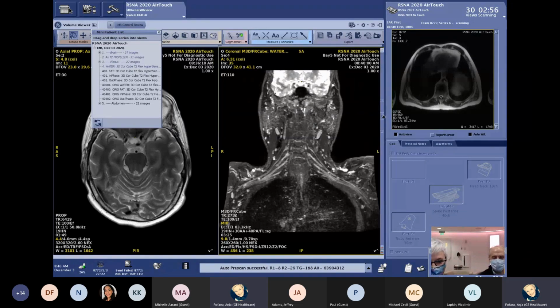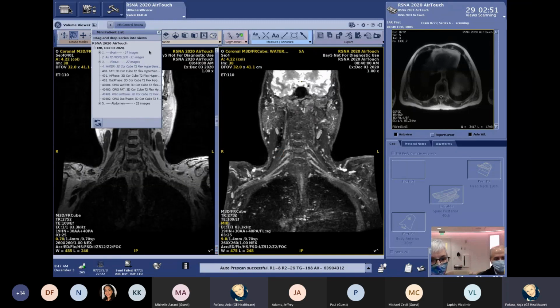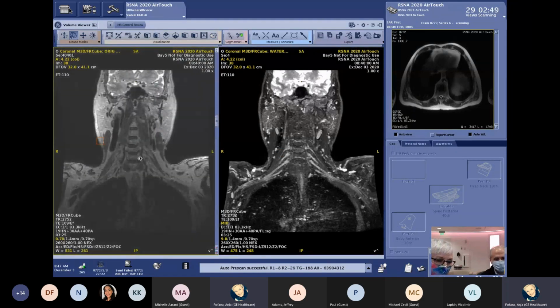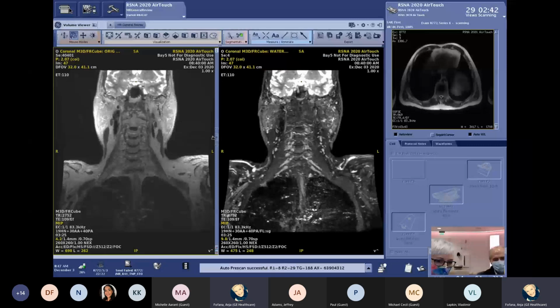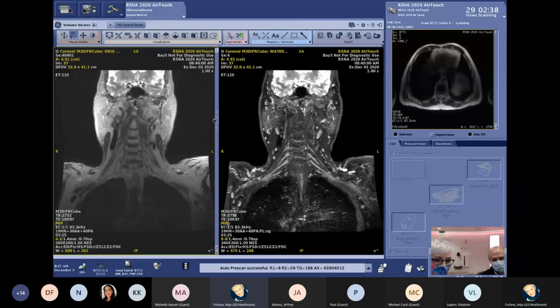The nice thing with this too is you've applied FLEX with this, so it's a Dixon technique. So you're going to get a lot of data with this particular 3D volume. So you're going to get the in phase, out of phase, fat image. So that is what Steve mentioned. Since we did the Dixon technique, I will show you in the other image here the in-phase image as well. So everything has been acquired in one image, and you have all the data available and ready for use.